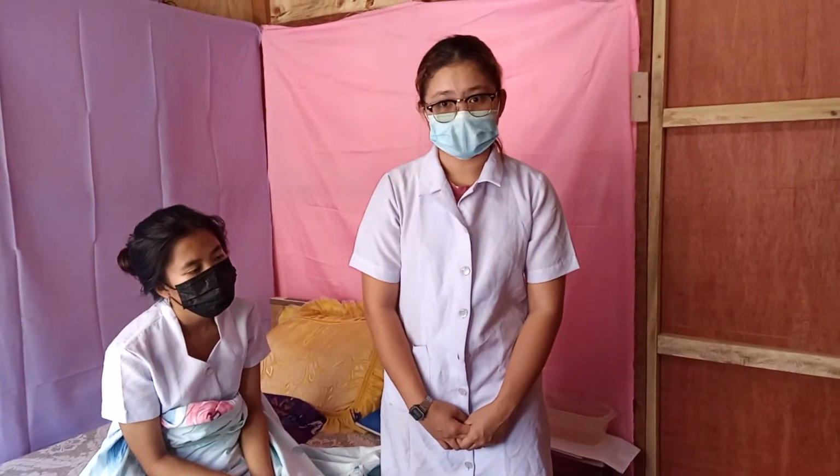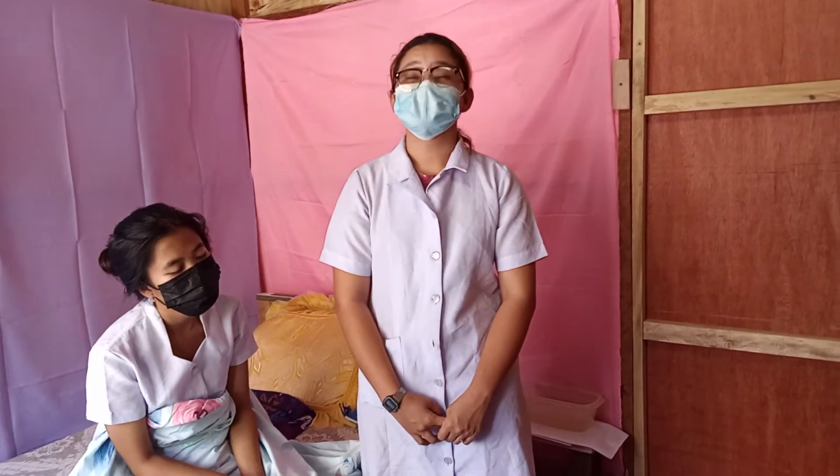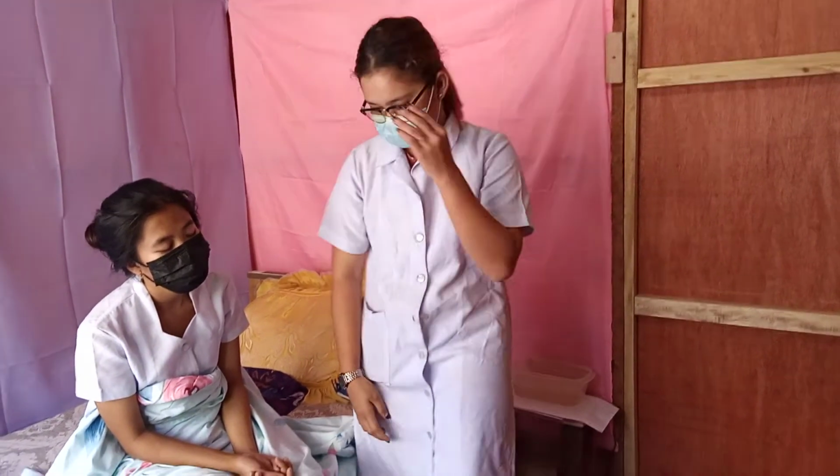Place the lower border of the cuff at approximately 2.5 cm or 1 inch above the antecubital space. Rationale: pressure in the cuff applied directly to the artery will give the most accurate readings.